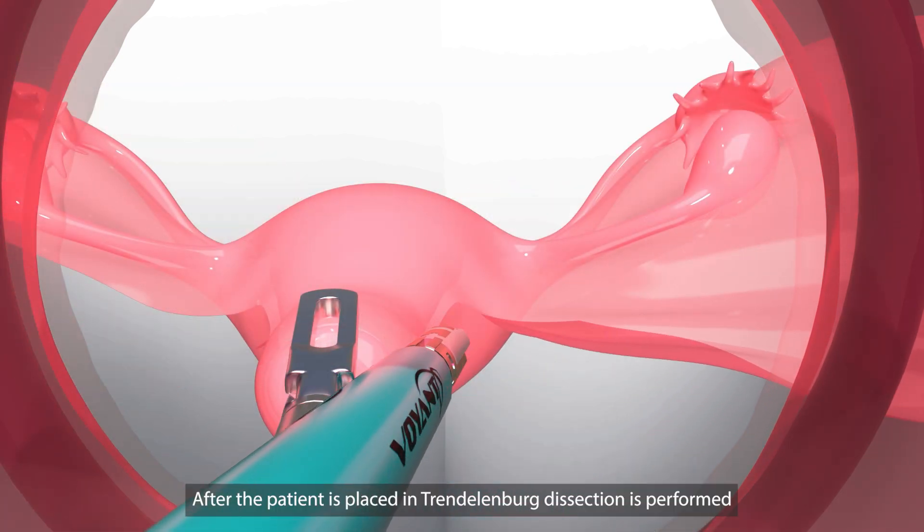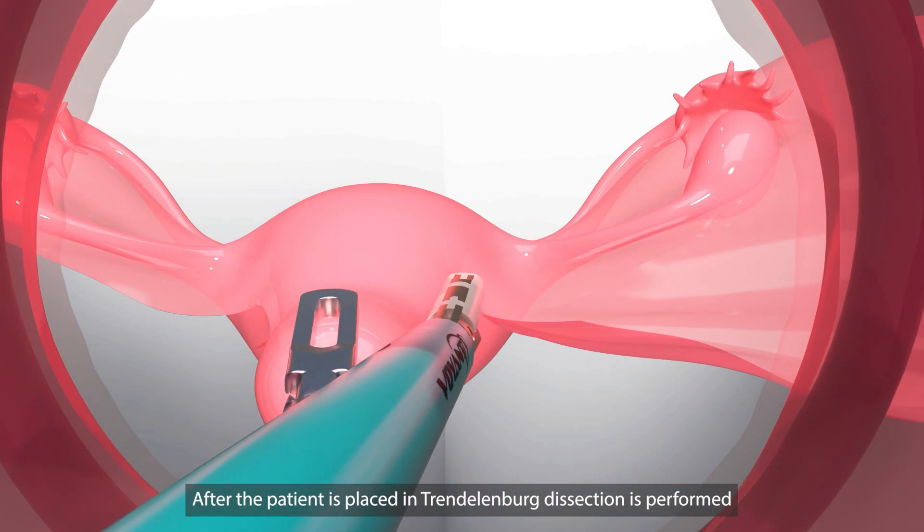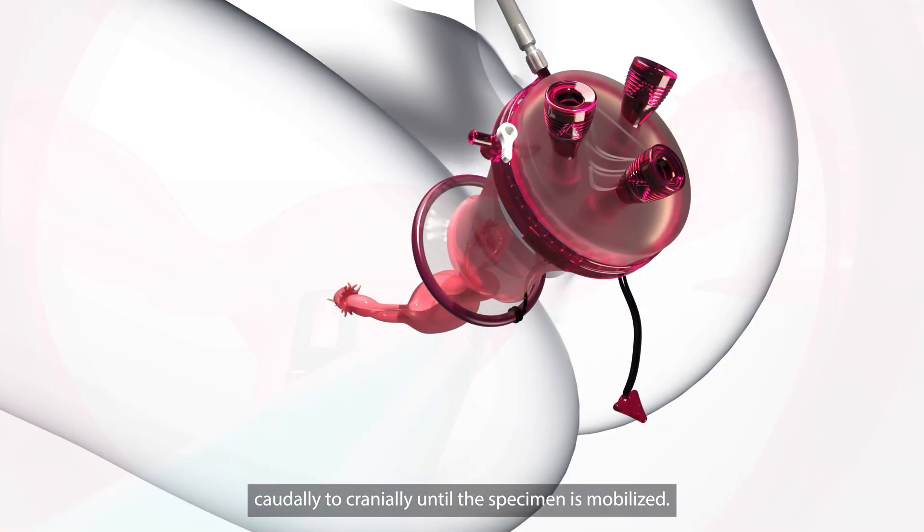After the patient is placed in Trendelenburg, dissection is performed caudally to cranially until the specimen is mobilized.